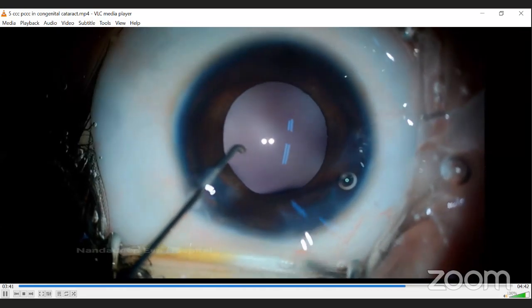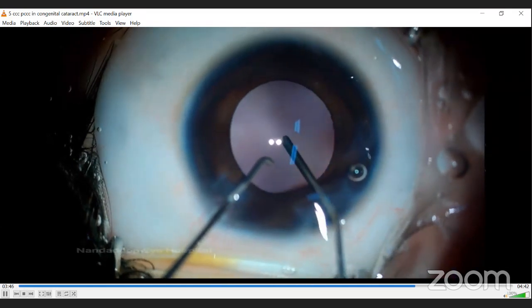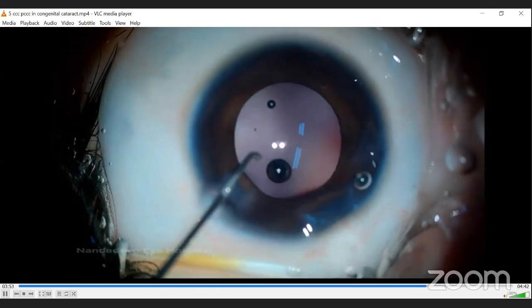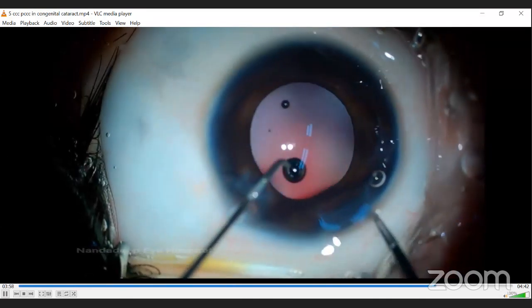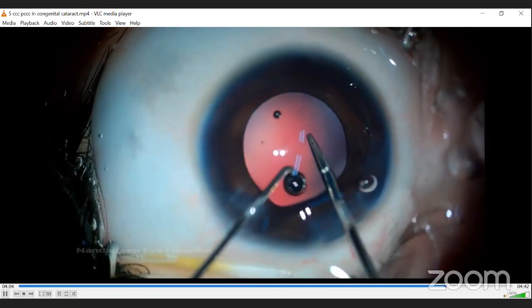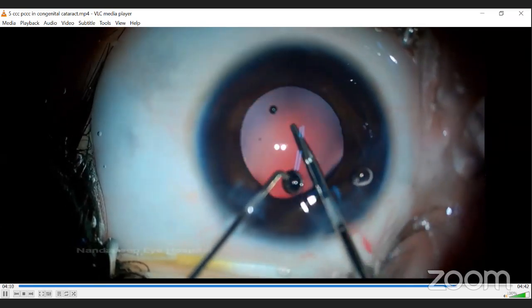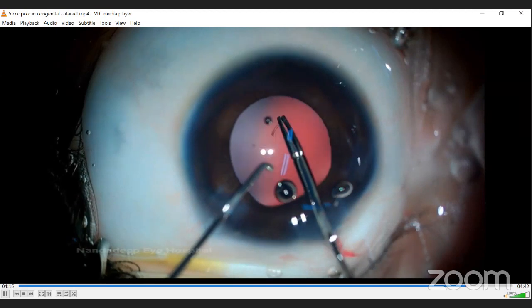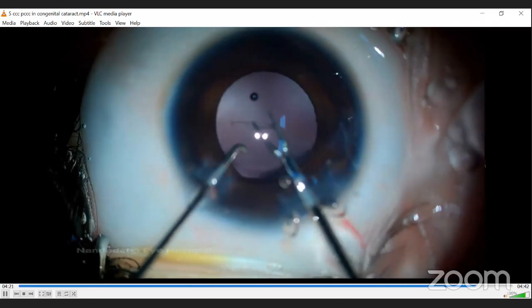And now I'll push some hyaluronate through this nick so that the anterior hyaloid gets separated. You can see the small bleb which is being formed there, indicating that the anterior hyaloid is separated. You can also make a larger bleb. And now I go in with microcapsulorhexis forceps. The movements are similar to anterior CCC, but here the posterior CCC tends to be smaller than what you expect. So you can try to enlarge it a little bit. You need around 3.5 millimeter posterior CCC here.